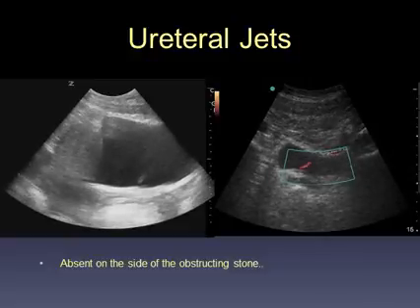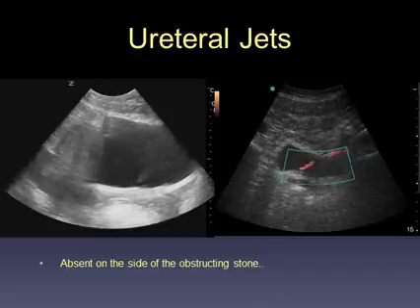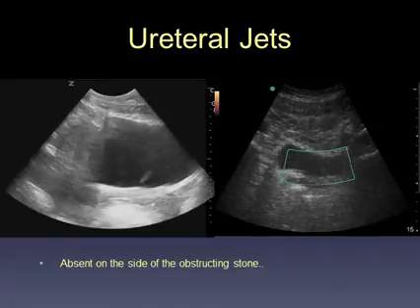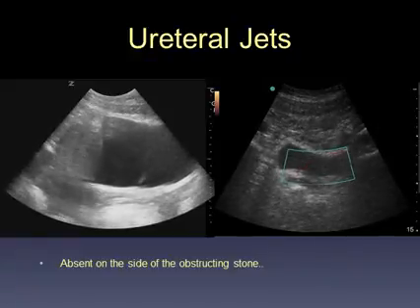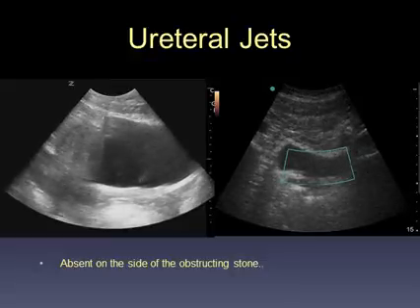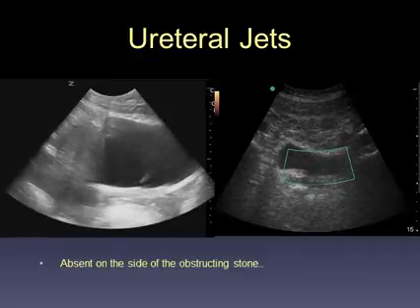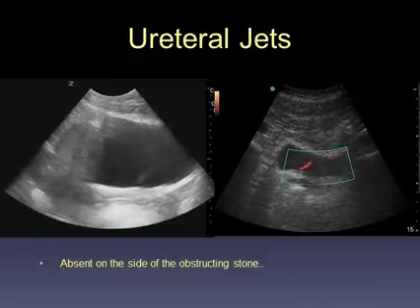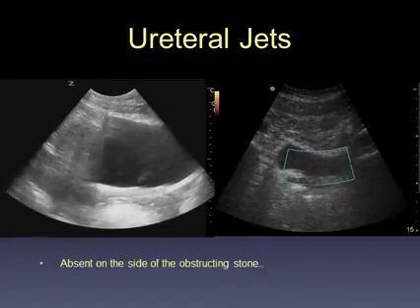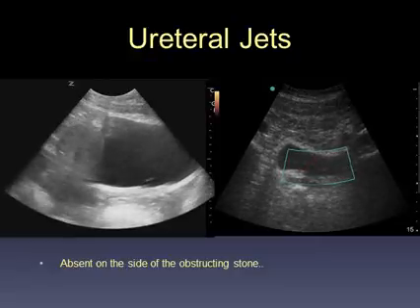Observing the ureteral jets may be helpful in identifying blockage of the ureters. Now, as the ureters join the bladder at the level of the trigone, they form an acute angle and have a narrowing of the ureterovesicular junction. As the urine comes down under peristaltic pressure, this causes a turbulent flow to be set up and creates this eddying, swirling appearance that we see on the left-hand side. It isn't always this obvious, and you can put some color flow Doppler, as we've done on the right, where you see the characteristic flamethrower-like appearance of the ureteral jet.